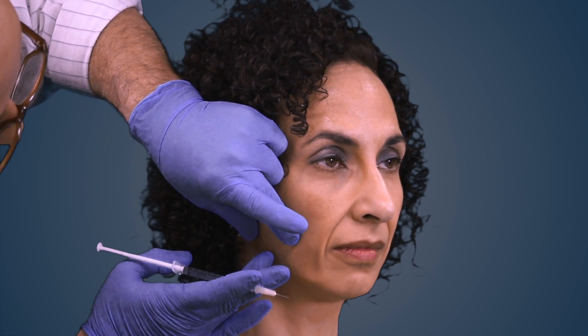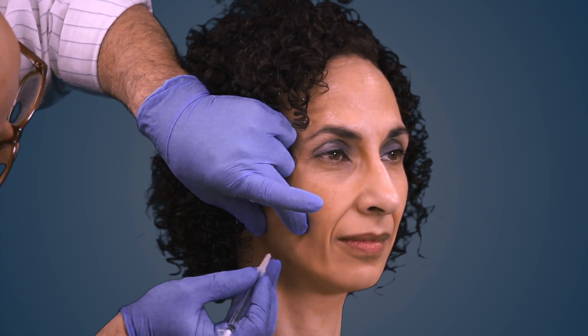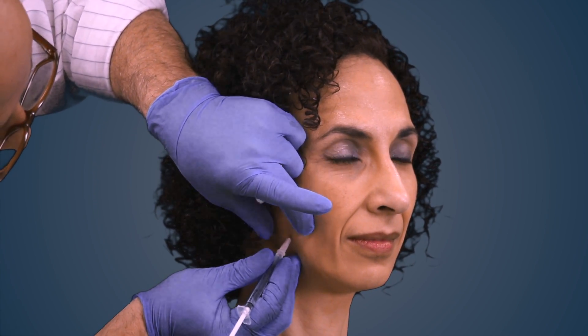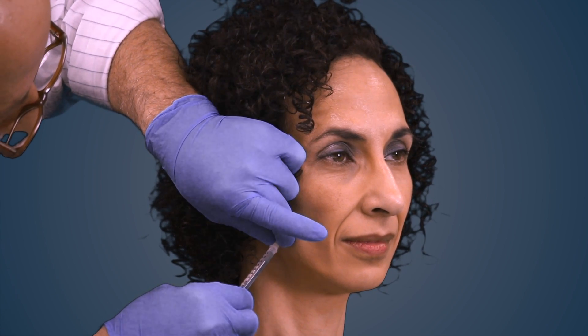We'll start the series by injecting the masseter. We'll ask the patient to clench. Clench for me please. We palpate the muscle and inject right on the muscle, putting a total of 10 units of botulinum toxin.